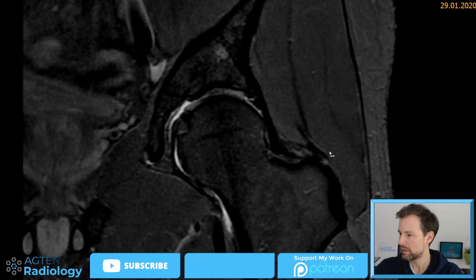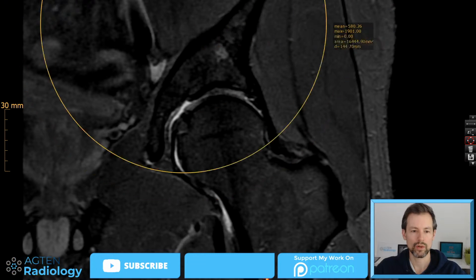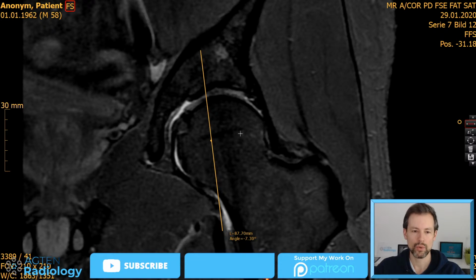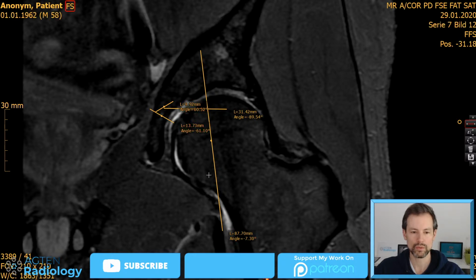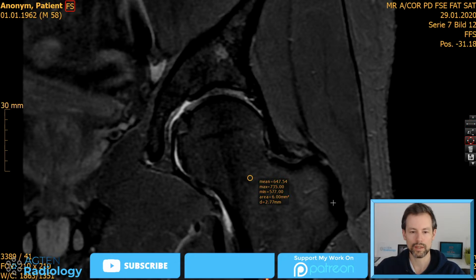Nice video. Which approach do you prefer for hip arthrography? So which approach I use for hip arthrography? It's very easy. I always do the following approach. So AP a little bit externally rotated, or basically a little bit elevated hip, so that the nerve etc. goes this way. If you elevate the lateral portion, it goes a little bit more in this direction, the nerve etc. So you are less likely to puncture any relevant structures. And then I point the needle just down to the neck. That's my target site.